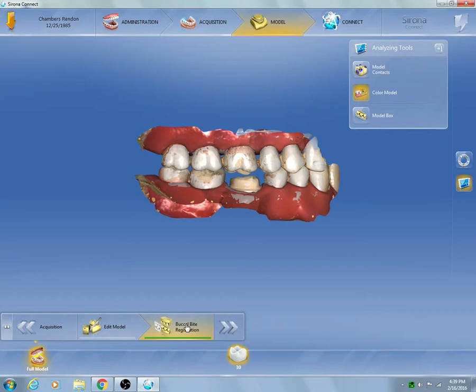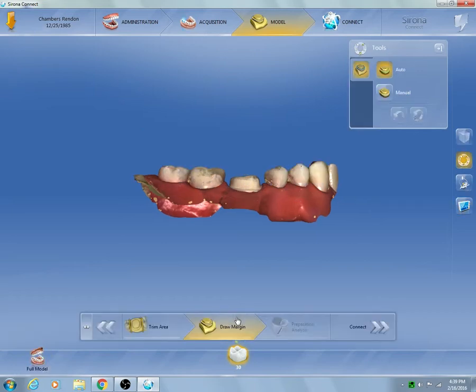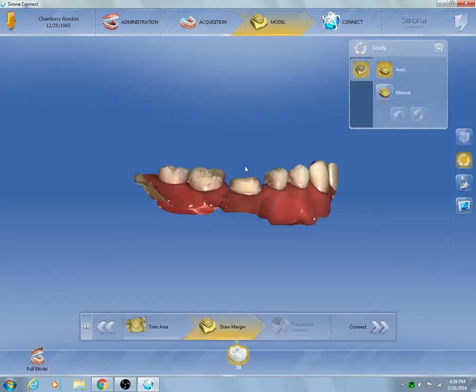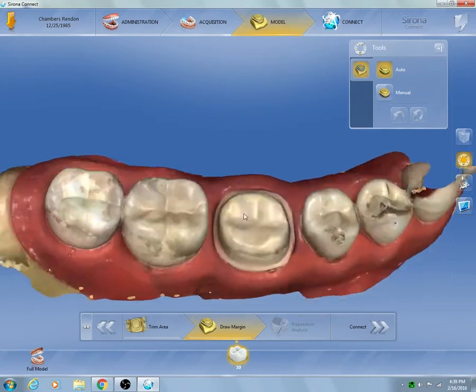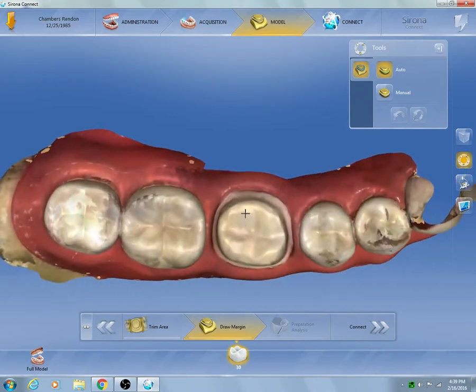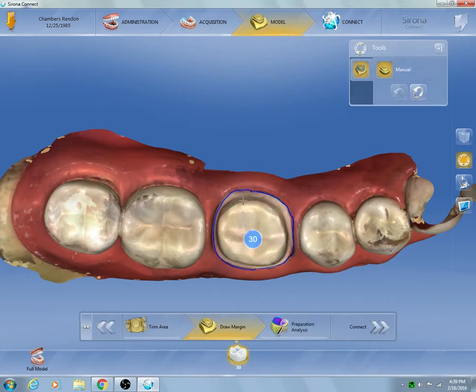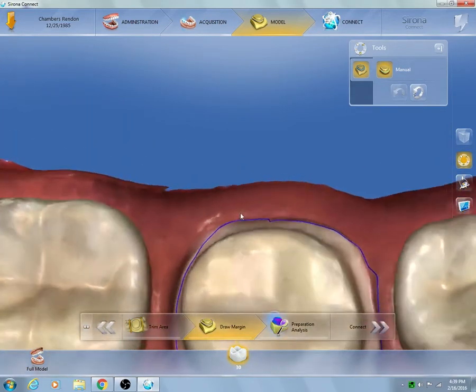Now that we have this information stitched, we can move on to the margin stage. We're going to zoom in onto the prepped area, double-click, drag across the prepped area, single-click, drag back across, and double-click on the red dot.